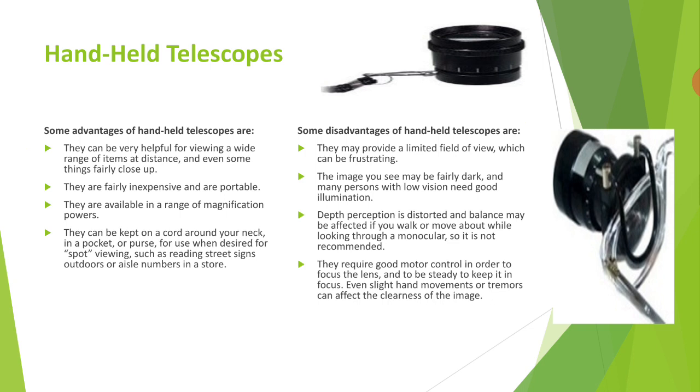The advantage of using the handheld telescope is that it can be very helpful for viewing a wide range of items at a distance and even some things fairly close up.